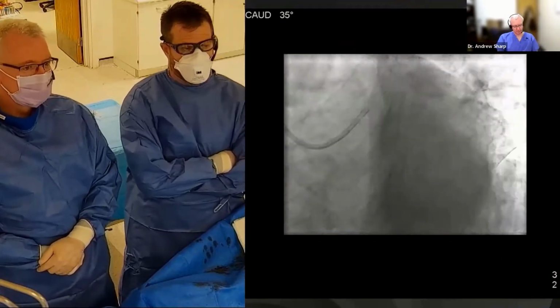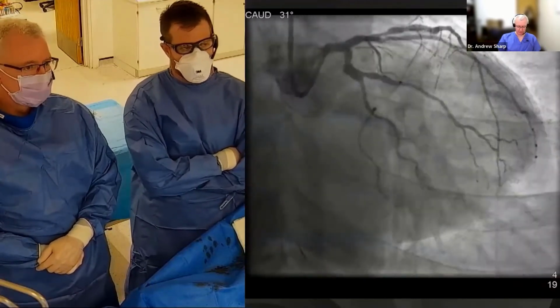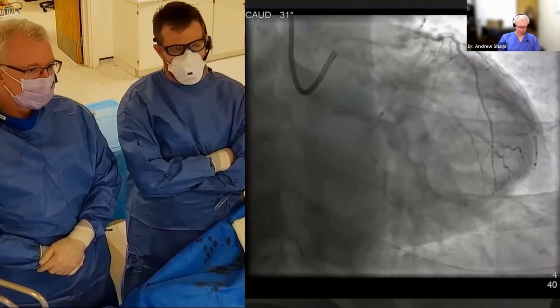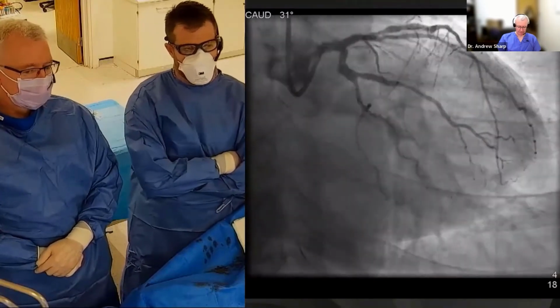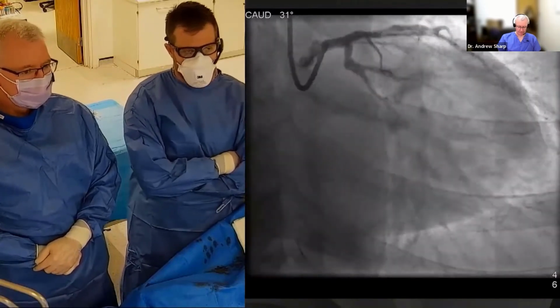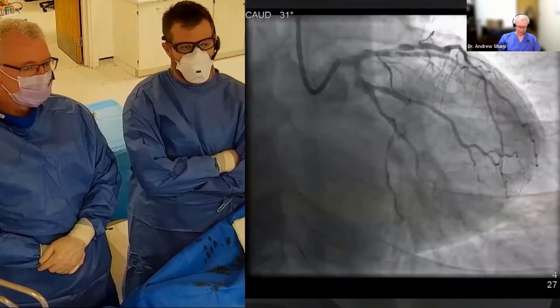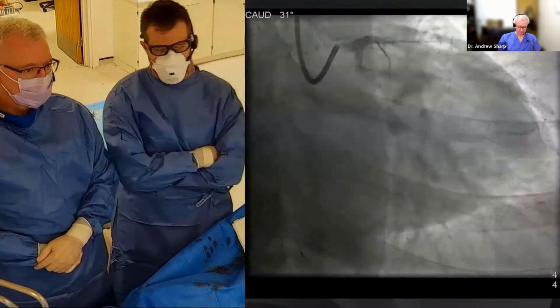One further. And you're seeing a pretty normal looking proximal LAD, so I'm expecting to find a landing zone in the proximal LAD. The one thing I look at with the angiogram is there's probably a little bit of calcium in this. We may be underestimating it, but I think IVUS will have the answer. So strategy-wise, I would start here with an IVUS looking for landing zones and to get an idea of plaque morphology. What are your thoughts, Andrew?